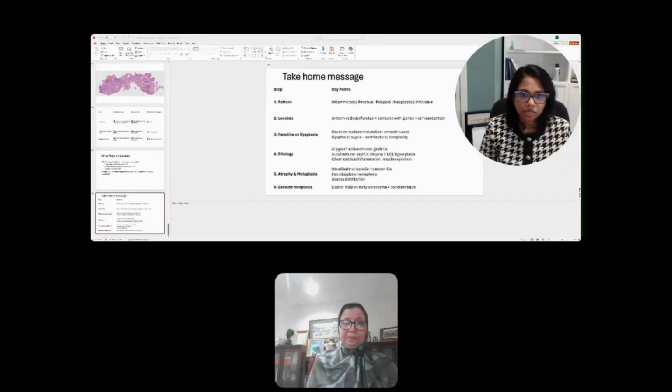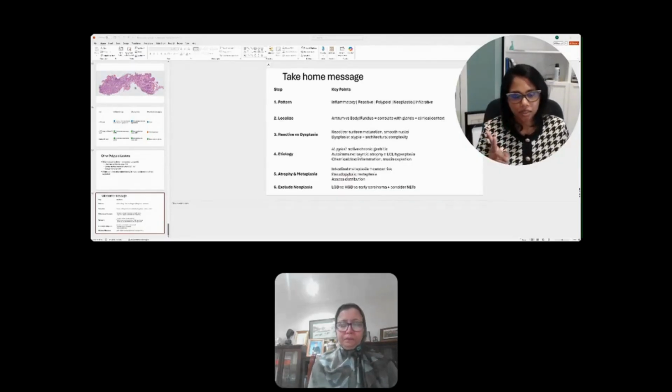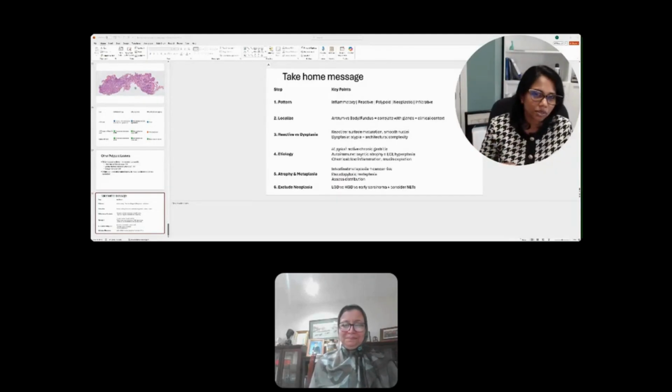Yeah, absolutely. Like I said, when we see them, you're just delighted because they're usually in the pools of mucin, and you're very happy. And sometimes when they're lurking in the pits, you can find them. But when I can't explain the degree of inflammation, so two scenarios that I might do it, and I used to have a higher threshold of ordering it, but now I have a lower threshold.